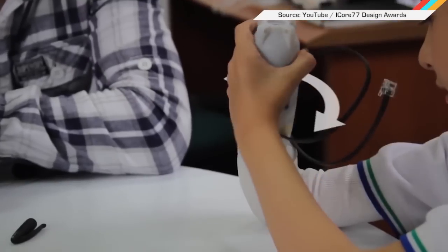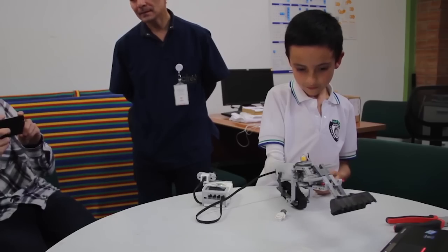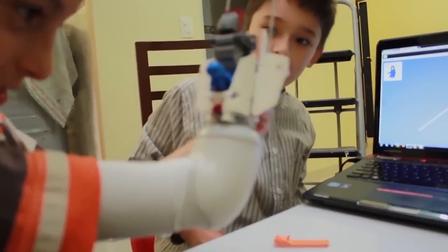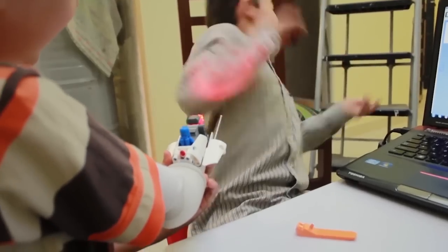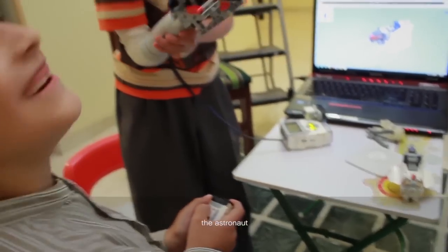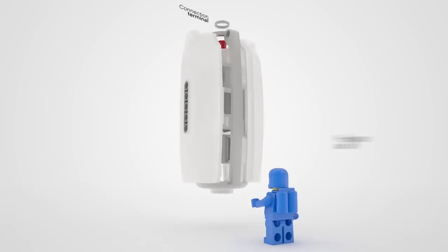The idea behind this invention is: if you've got to have a prosthetic arm, why not have as much fun as possible? This is a prototype of a LEGO-compatible arm for kids called the Eiko Creative Prosthetic System. All LEGO creations are changed out via the pop-and-lock connector in the forearm section.